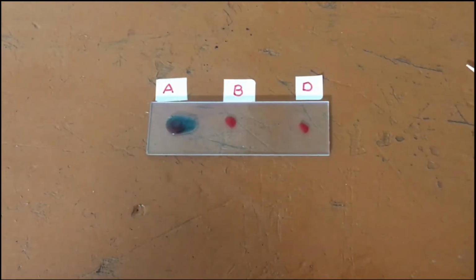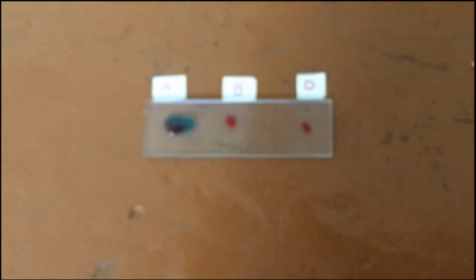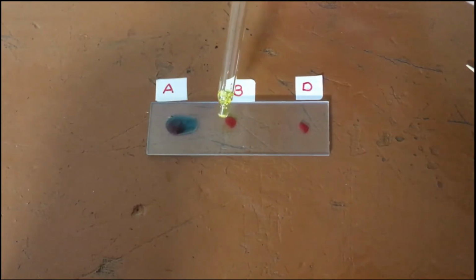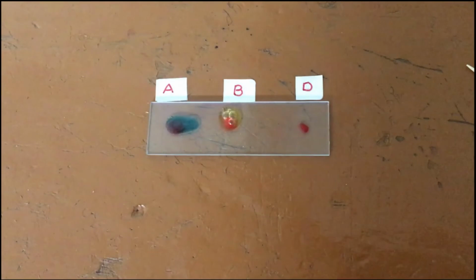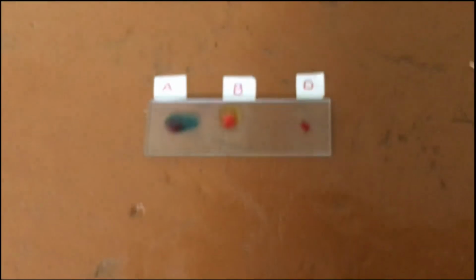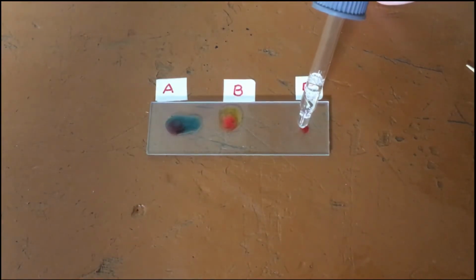And next we are going to add B antisera. This is B. And next we need to add anti sera D. This is anti sera D. We need to add anti sera D.